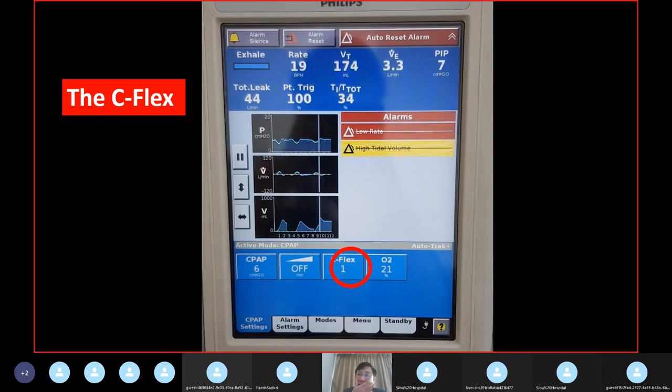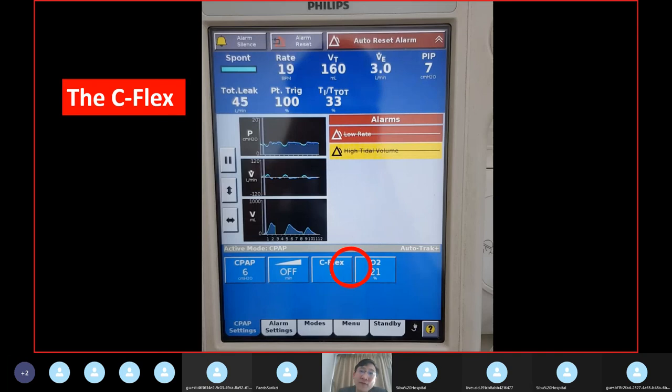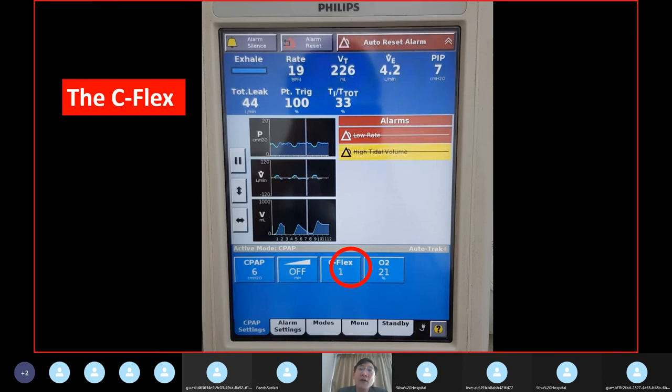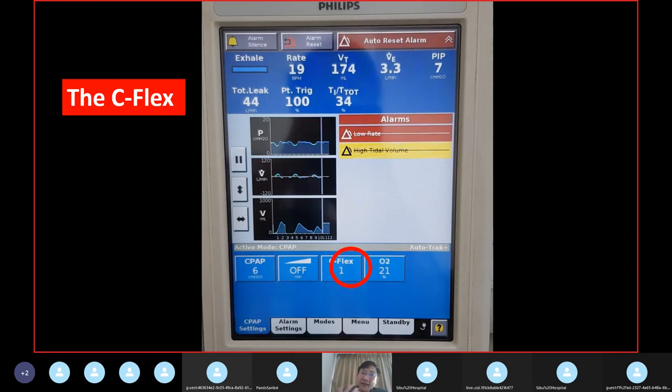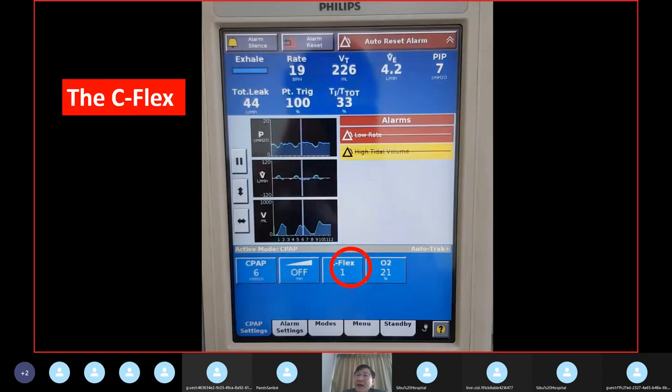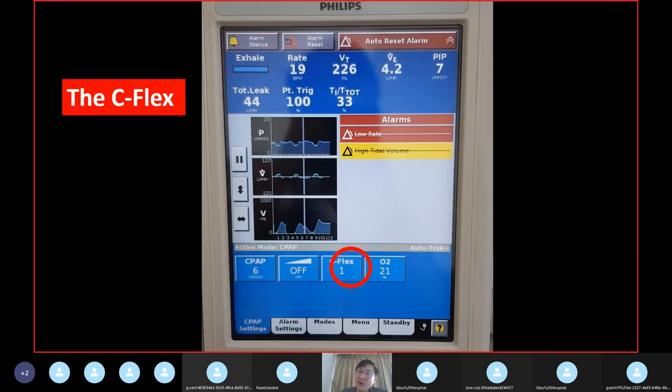From the CPAP, most of the time I will start on a very, very low CPAP pressure as well, because the lowest pressure the machine can go is 4. So when I put on the patient, after they are confident, I give them a pressure of 4, but I give them 100% oxygen. This is what I usually do: 100% oxygen, low pressure. Do not look at the saturation, because sometimes you'll be very scared and tend to escalate the setting very fast. The first thing is to gain the confidence of the patient and let them feel comfortable.